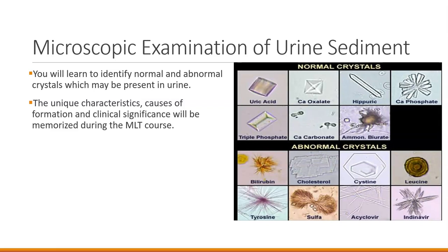As an MLT, you will learn to identify normal and abnormal crystals which may be present in the urine. The unique characteristics, causes of formation, and clinical significance, meaning are they associated with the disease or not, will be memorized during the MLT course.